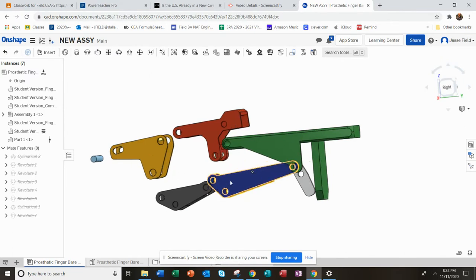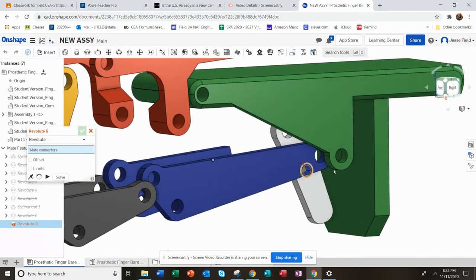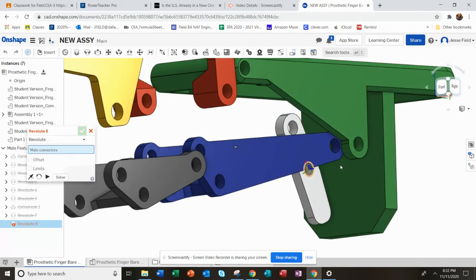To get this right, I'm basically going to do revolute mates along the top and two cylinder mates along the bottom. I'll start all the way back here at the lever.